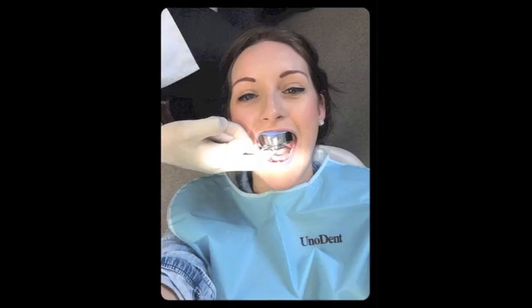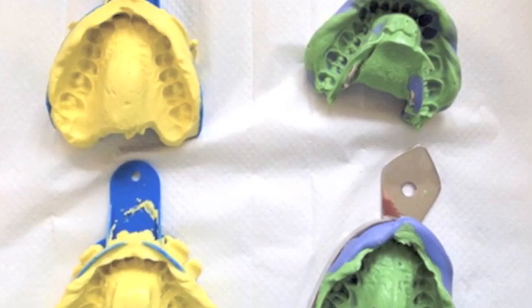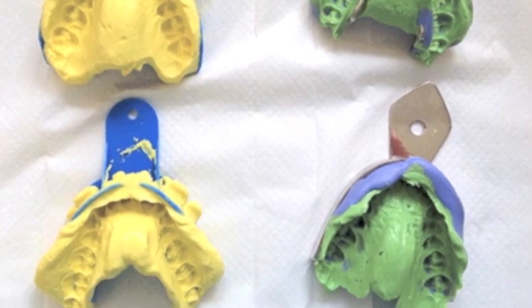I went for my consultation for the 6-month smile about a week ago now, and today I came in to have my mouldings done, which is a tray filled with a kind of gooey jelly stuff that you pop into your teeth, and it takes an impression and a moulding of where they are at the moment. It's also used to chart progress and for them to know at the dentist exactly how much to do to what tooth.